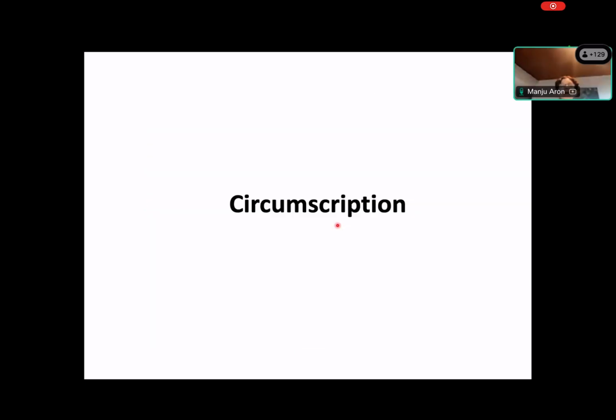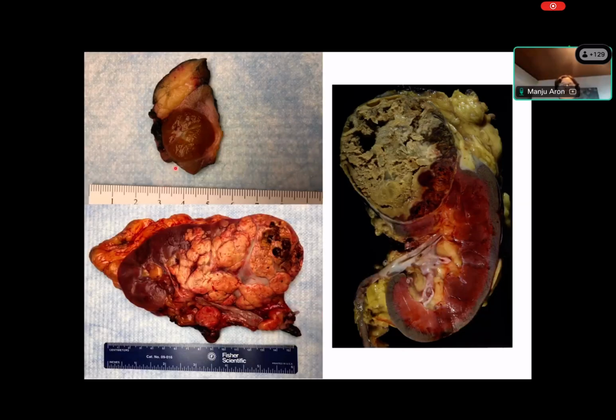The next thing you want to look at, other than the color, is the circumscription, right? Is this a well-circumscribed tumor, as you can see here, or is it a tumor which has a very irregular interface with the surrounding renal parenchyma? Or here is a tumor which appears necrotic, but you can see it has a very well-defined capsule. So these terms are important. Circumscription, non-circumscribed, or a tumor which has a very well-defined capsule, so it's encapsulated. Oncocytomas are circumscribed, but they do not have a capsule. Papillary RCCs usually are circumscribed and have a very well-defined capsule.